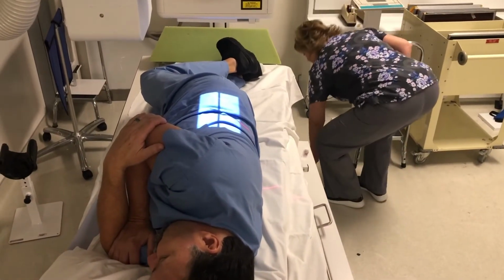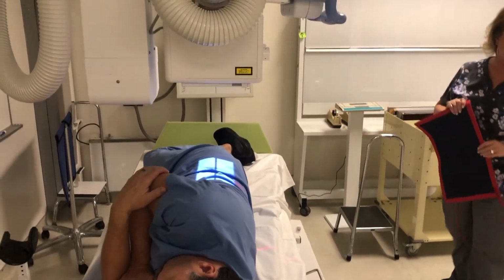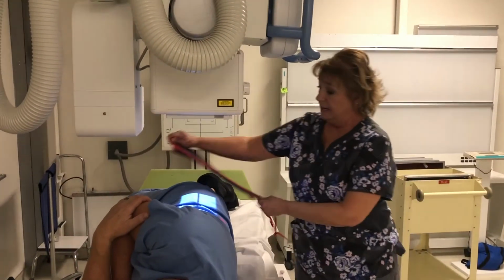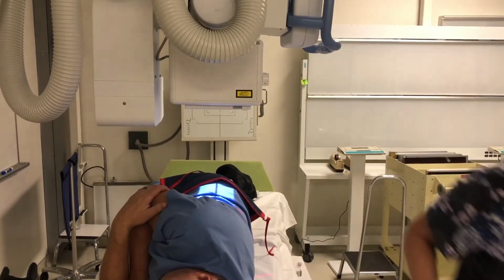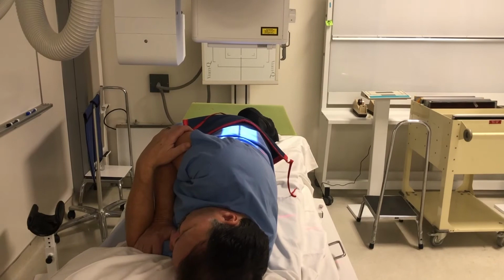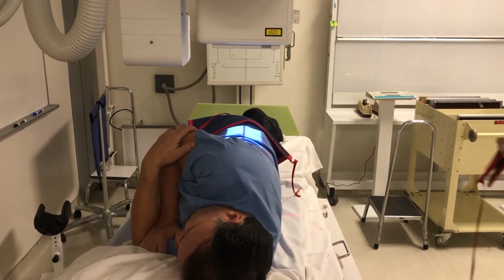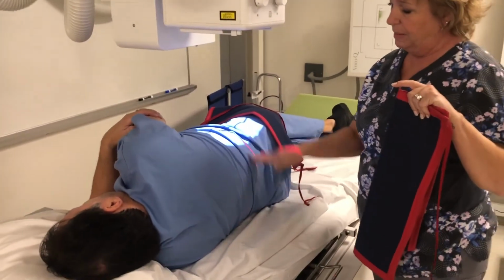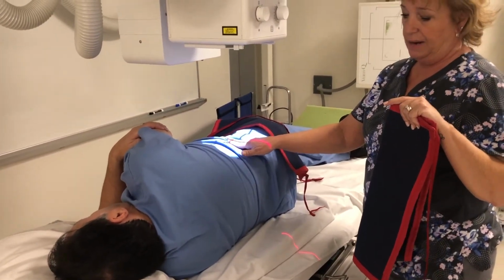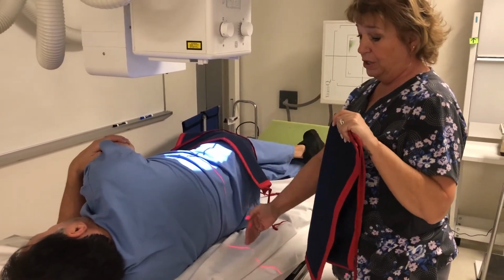One thing you're going to want to do on a lateral L spine and a lateral T spine, in addition to your gonadal shielding, is also put lead shielding right behind the patient outside the field of view. Because this is a very thick body part, it's going to generate a lot of scatter, which can end up on your image receptor.